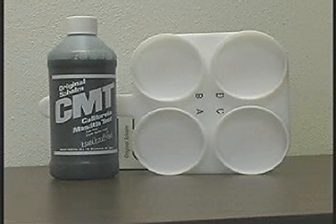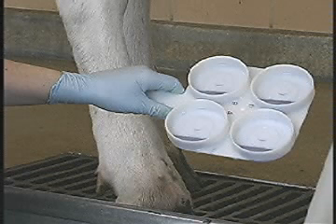CMT scores are directly related to average somatic cell counts. The somatic cell range can vary from 0 to over 5 million cells per milliliter of milk. Any reaction of trace or above indicates that the quarter has subclinical mastitis.